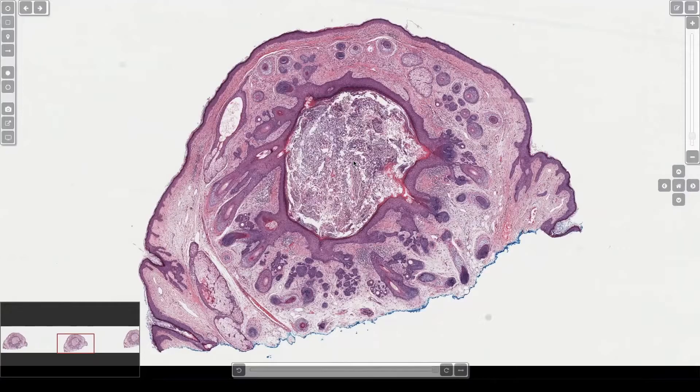And so what happens is, this is true in molluscum or any of these kind of crater shaped things in some of the keratoacanthoma type squames, if you cut just a little away from the center, they can look like a cyst in the dermis. So it's real important to recognize that cyst in the dermis and umbilicated crater shaped lesion. Same thing, just sectioned differently.